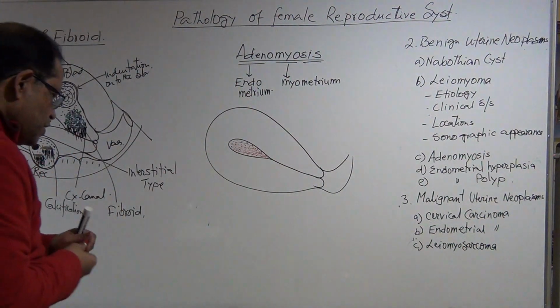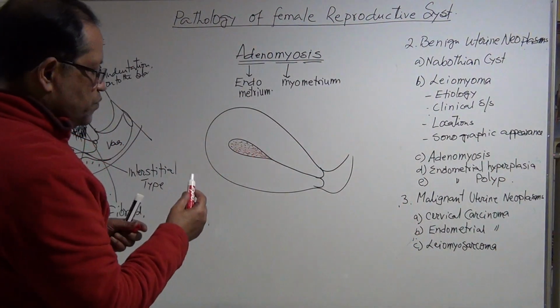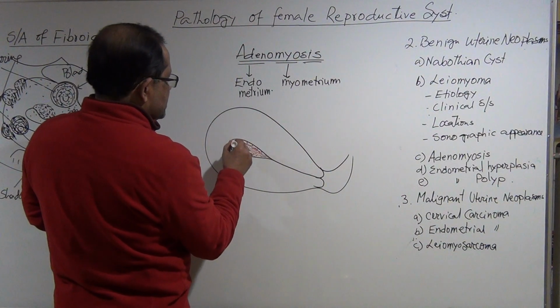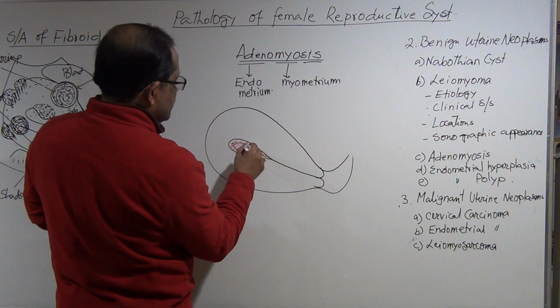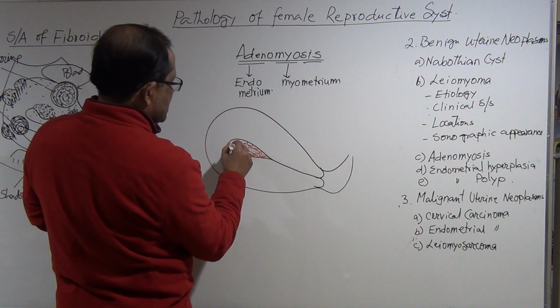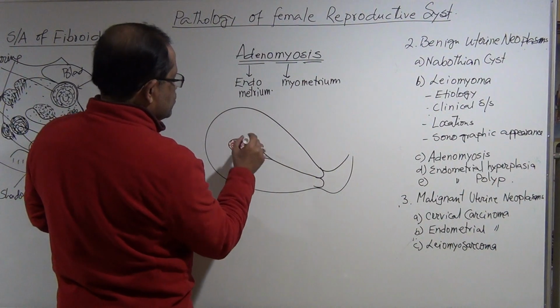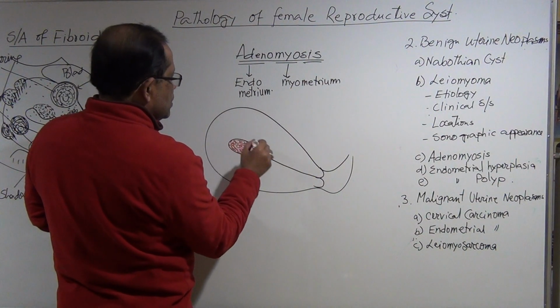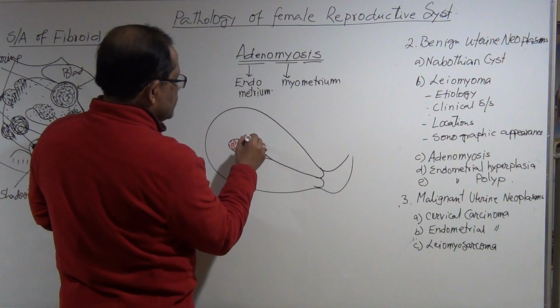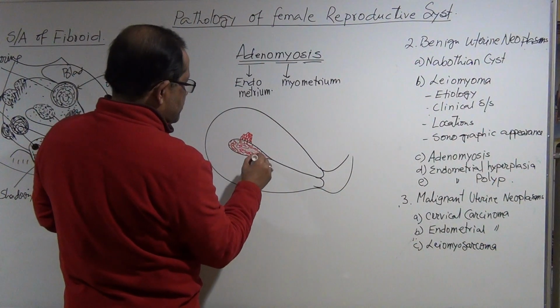But now if you see this endometrium, okay, let me make it a little brighter. And now if you see, this endometrium is growing through the myometrium.